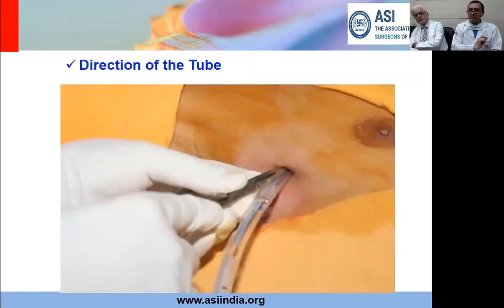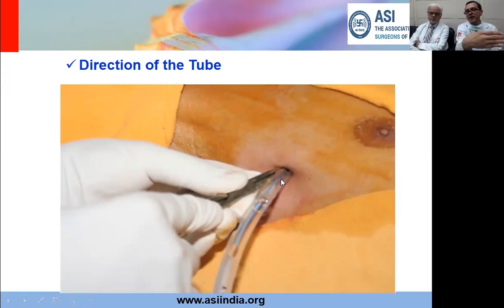Now, what direction? It's important because once the tube goes in, it is your artery forceps which will direct which way it will go. You might like to direct it downwards in the posterior recess, with the tip of the tube lying in the paravertebral space. That's the commonest position that we aspire for. But sometimes you might like to direct it upwards towards the apex. So you have to decide beforehand, and accordingly, the artery forceps will direct. Whichever direction, if you want to direct cranially, your artery forceps and the tube will be directed cranially.